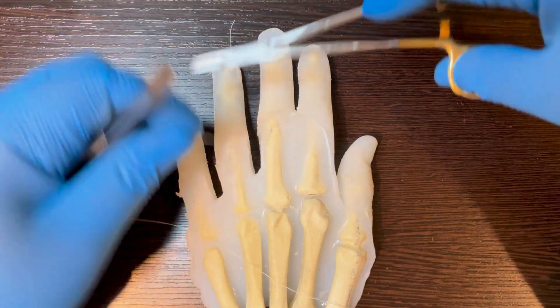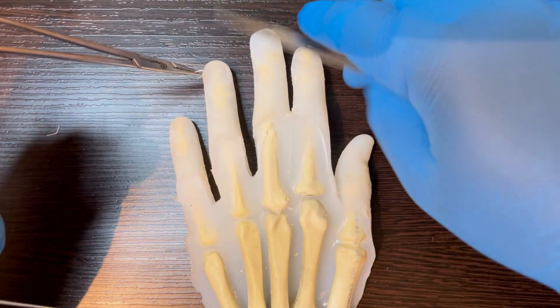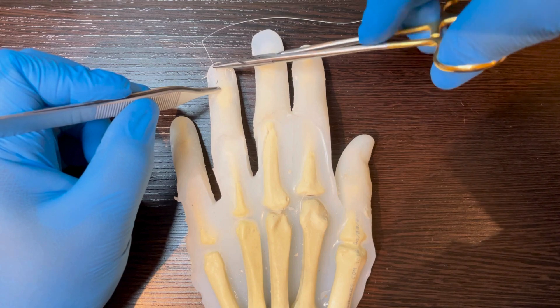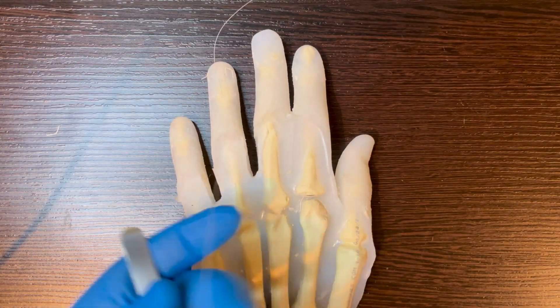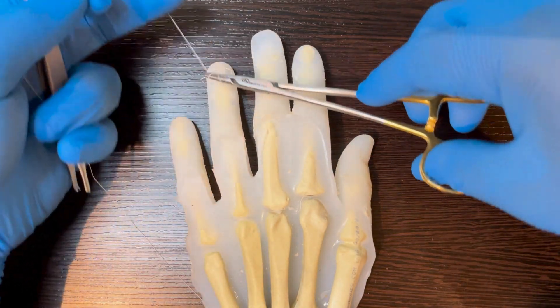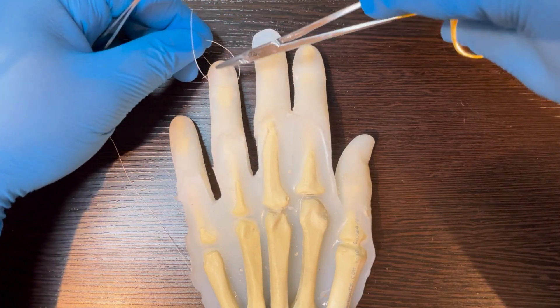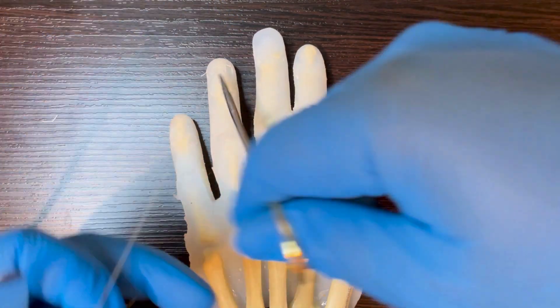The nail bed sits right on top of the bone, so your suture does not need to go deep. As soon as you enter, let your wrist rotate so the needle quickly curves up and doesn't just scrape the bone. You can't be too rough or pull the suture too hard, as you may pull the fragile injured nail bed off the finger. Once you've tied your secure knots, simply repeat this process until you've re-approximated the nail bed.